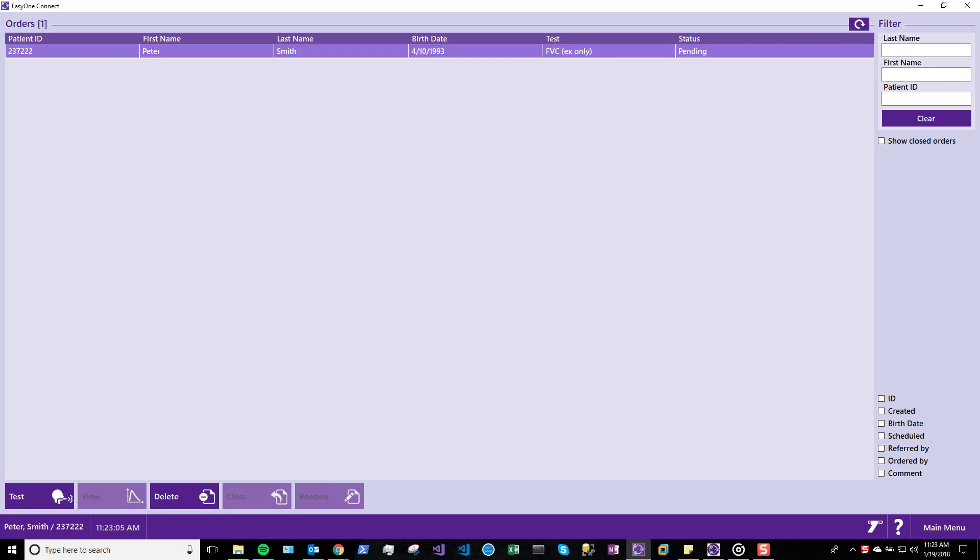Orders can have predetermined test types or can leave selection to the technician. In this demonstration, we will select an FVC test.